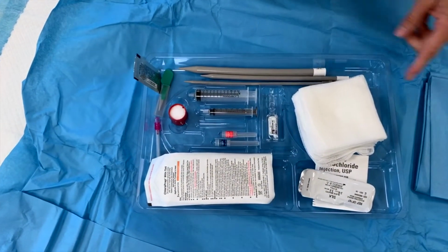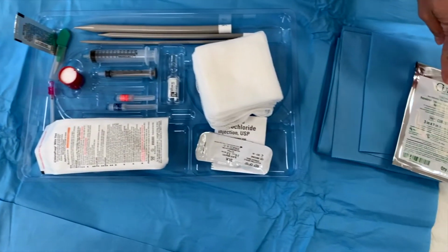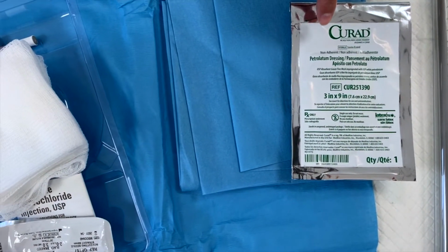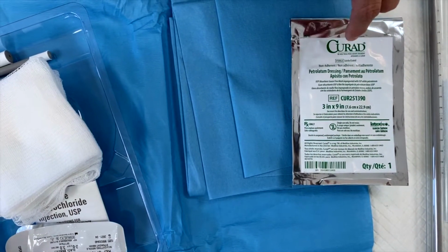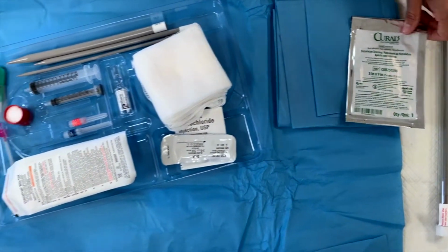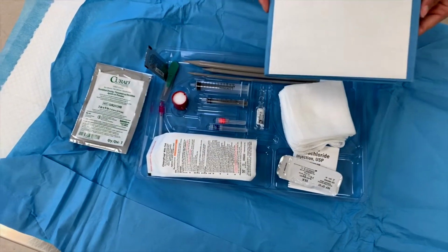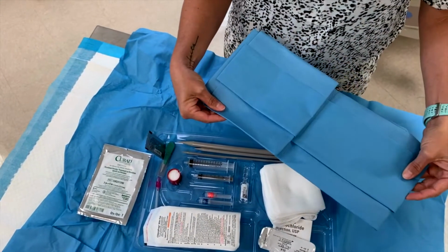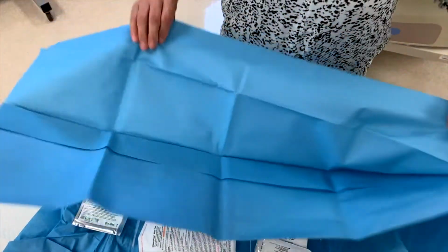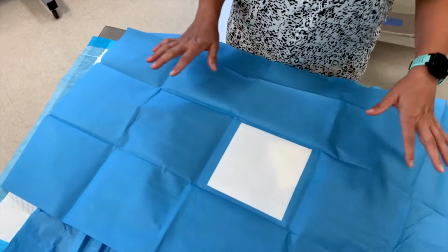Now, don't forget, you got to get some 4x4 gauze because you're going to need it. And then also that very, very important petroleum gauze that I talked about earlier today. That petroleum gauze is what's going to help with any prevention of air leaks at the actual chest tube insertion site. Okay, so that's generally what you're going to see in the chest tube kit. You're also going to have a drape here. This is just a drape that you're going to drape over that patient so that you can keep the site as sterile and clean as possible.